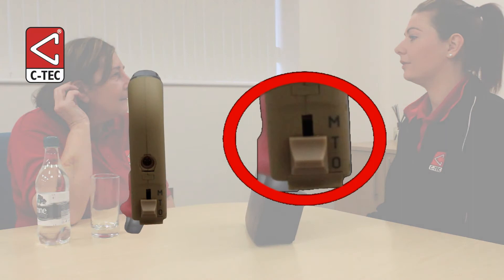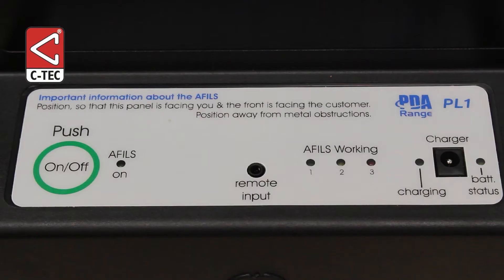Ask the hearing aid user to switch their hearing aid to the T position. Press the amplifier's on/off button once — the amplifier will beep to confirm it is ready to use.